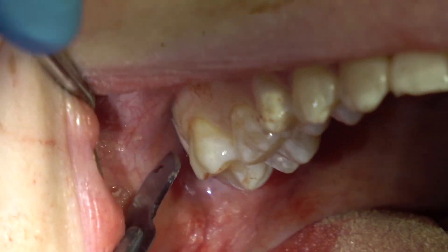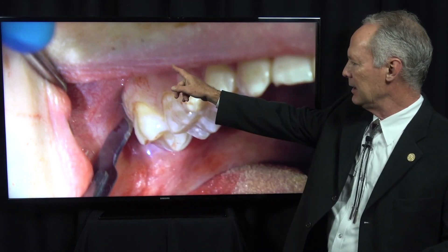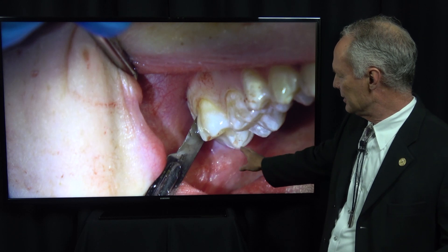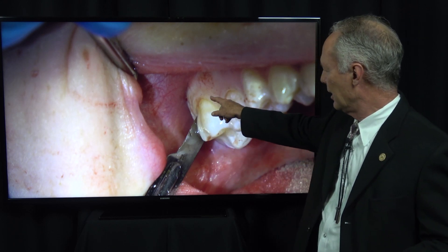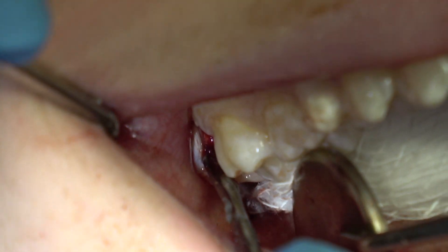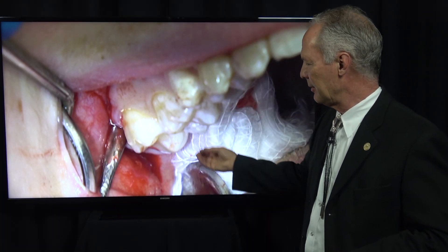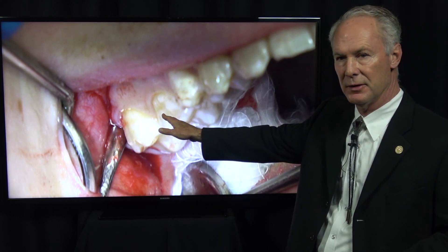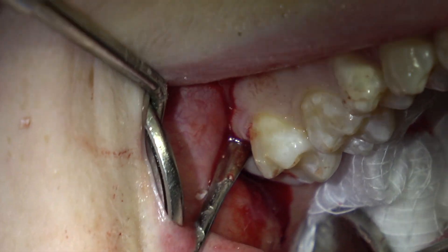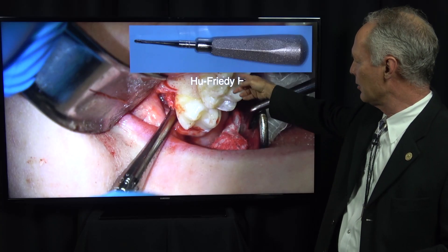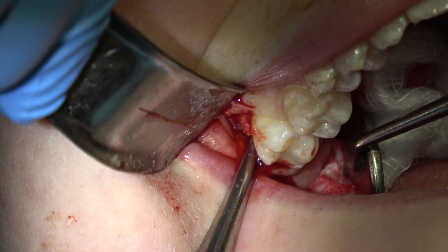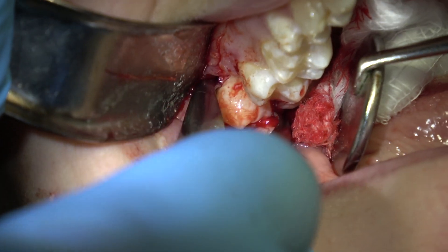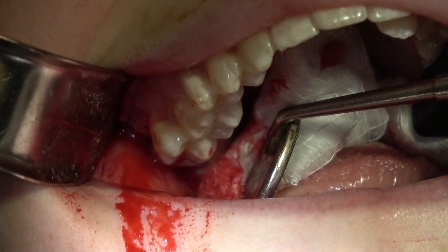Vertical incision on the distal buccal cusp of that second molar into non-attached gingiva — all the way to bone, a full thickness flap. Then cutting around the distal of that tooth, making an incision on the distal of the second molar around the facial. Elevating the flap with a periosteal elevator — you normally don't need a big flap unless the tooth is very impacted. Placing the periosteal elevator between the wisdom tooth and second molar, torquing to create space for the E301. Put the 2x2 in the mouth to protect the airway and it'll just roll right out.